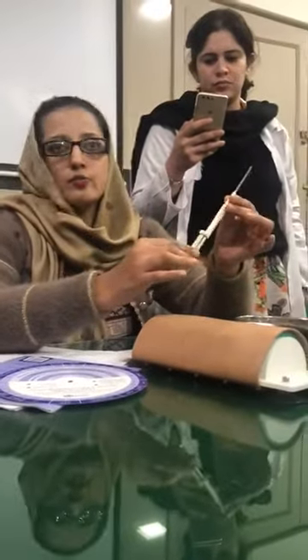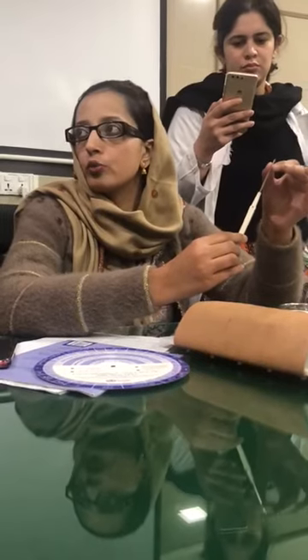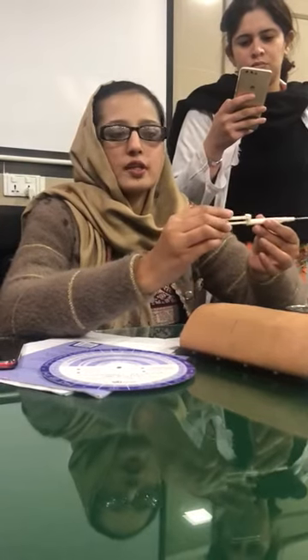This is the procedure. Inside the rod, there is a capsule in white color, which contains a hormone. This is a needle and cannula. This is an obturator. This is a seal.